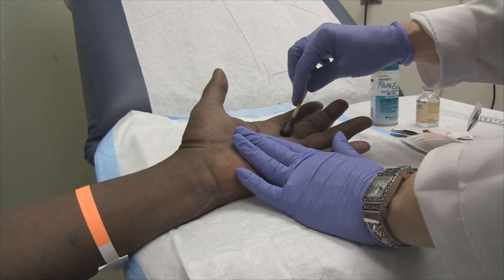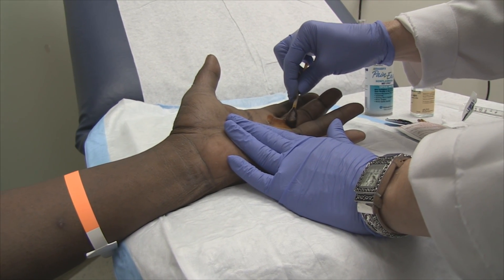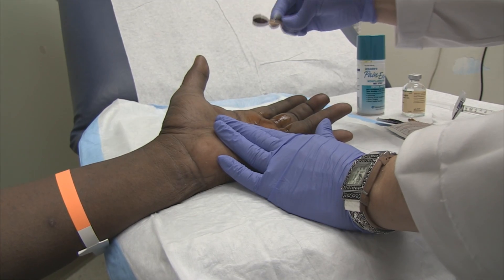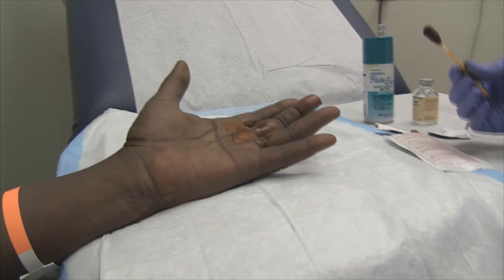Okay, this is dirty but it's really clean. We're just going to prep and we need to let it dry. Straight down here.